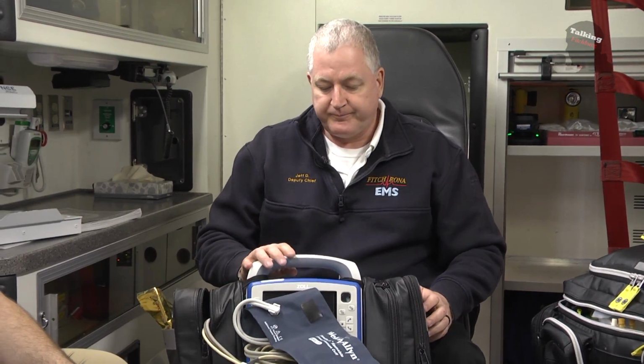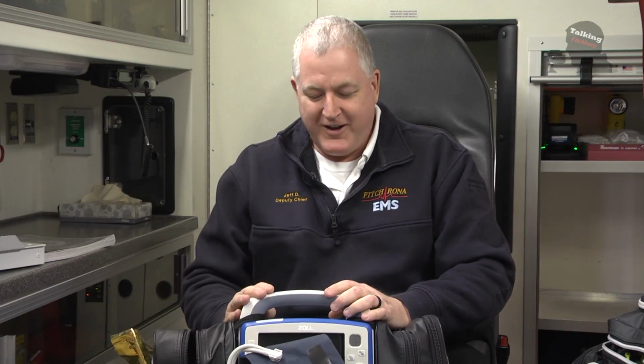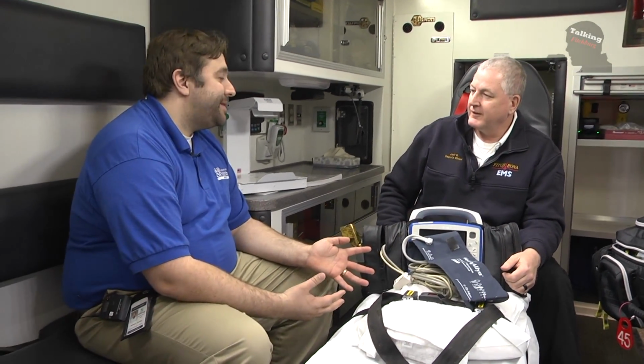So the monitor here is very versatile. It's compact, and not that we drop it, but if something were to happen to it, it's very sturdy, and we have good cases on there. It's a workhorse for sure. I think the take home is that if you're put on a monitor, it doesn't necessarily mean something's going wrong. It's nice that you're able to take vitals electronically, so if something else needs to be done, that can continue on its own and you can keep up on the vitals. Compact is good in the EMS world, I have to say.